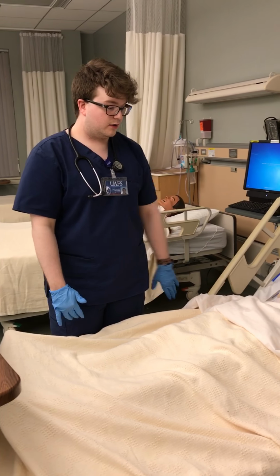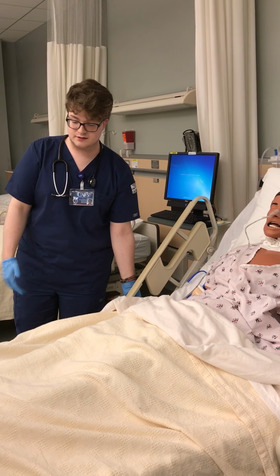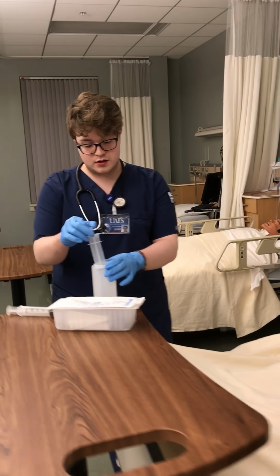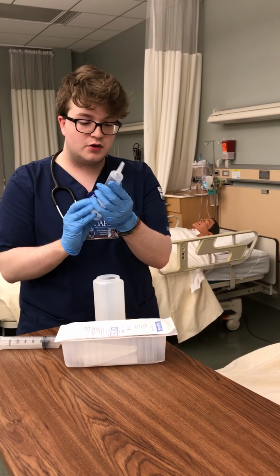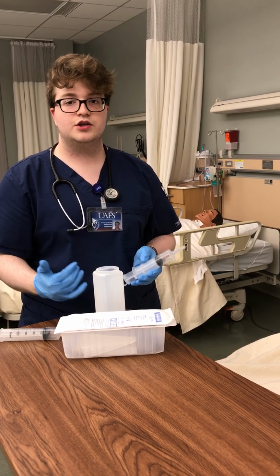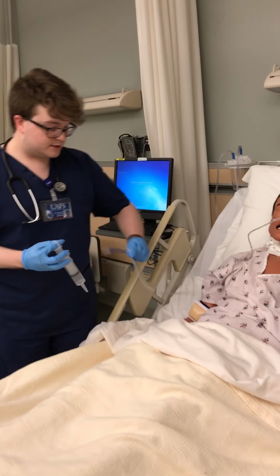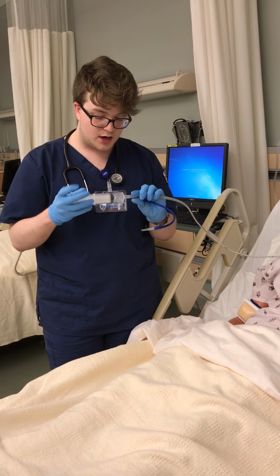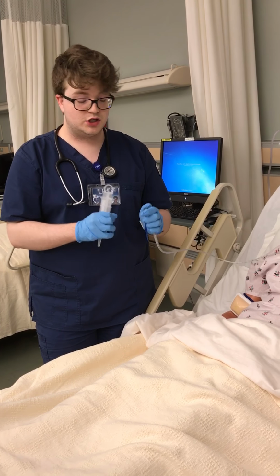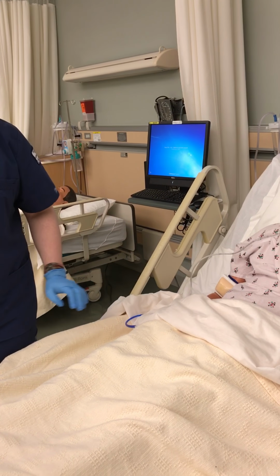So I'd unhook this, put it over here. I have the head of the bed elevated already. The only other thing I could do really is maybe pull the bed up so it's easier for me, but it's pretty much the same. So before you administer medications through an NG tube, you want to draw up about 30 milliliters of water, so you can do 15 before and 15 after to flush the tube. And as I'm doing this, I would make note of how much I'm putting into the patient. That way I can document it on intake and output later through the NG tube. So I just put in 15 milliliters there. Set this back in here.